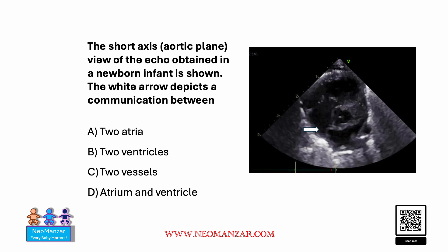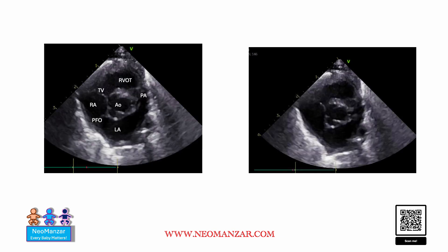Let's look at this picture — this is the still image and now it will start to make sense. The answer is PFO, patent foramen ovale, and it represents a communication between two atria.